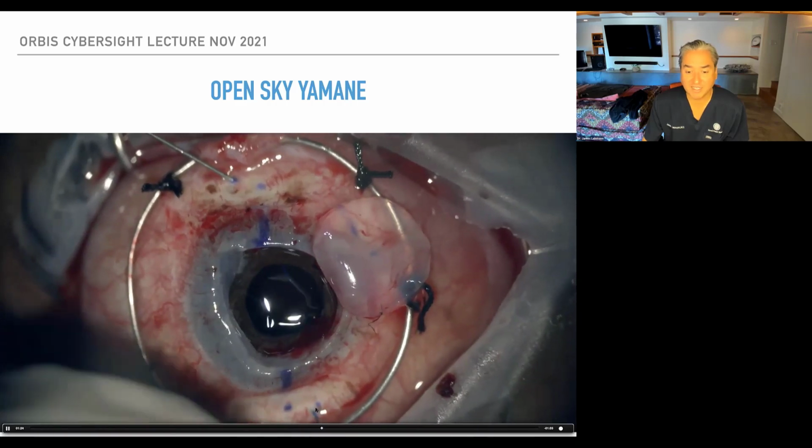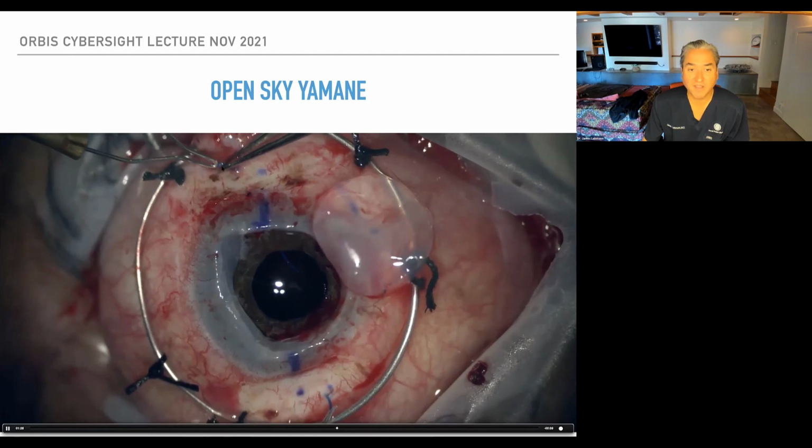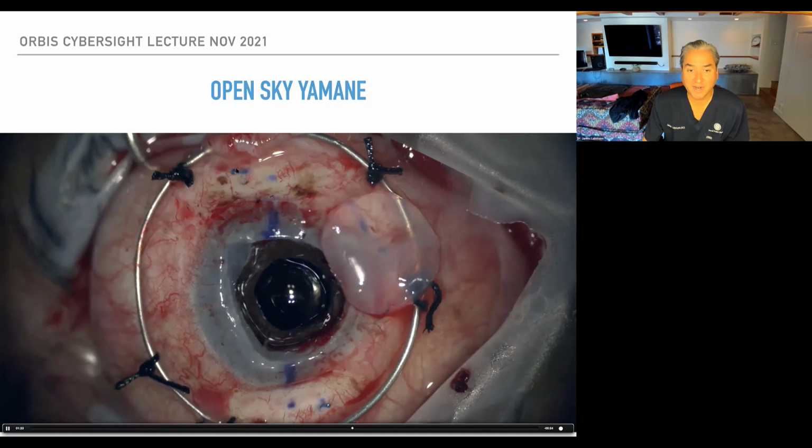I'm retracting the needles, and then you use cautery to do a little mushroom at the bulb of the haptic. Same down there. And then you're safe. They're not going to retract back into there. So now you can proceed with the corneal transplant part of it.